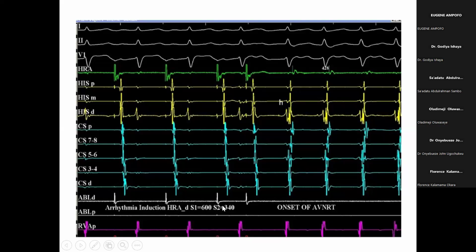Do you now see what happened around there? So this one too, you will notice this is the third cycle also happening. Okay, now I'll show you something. Look at the time interval between this first cycle and the second cycle. It's long now.